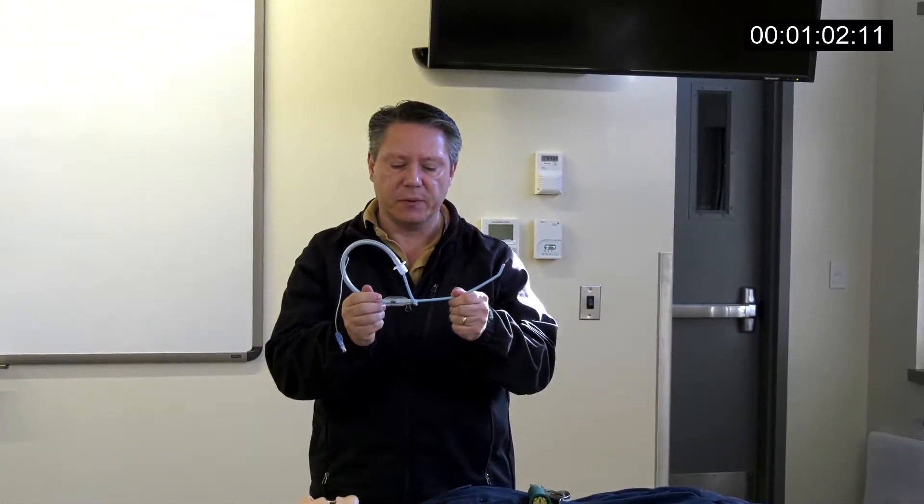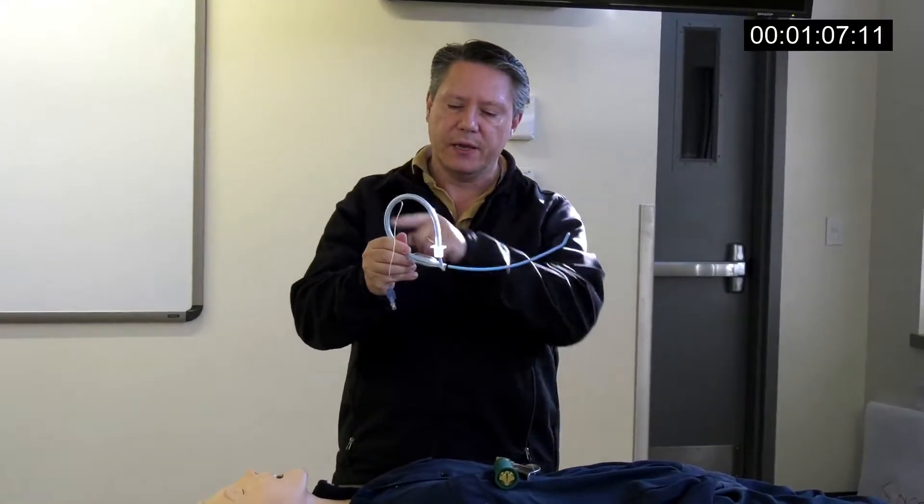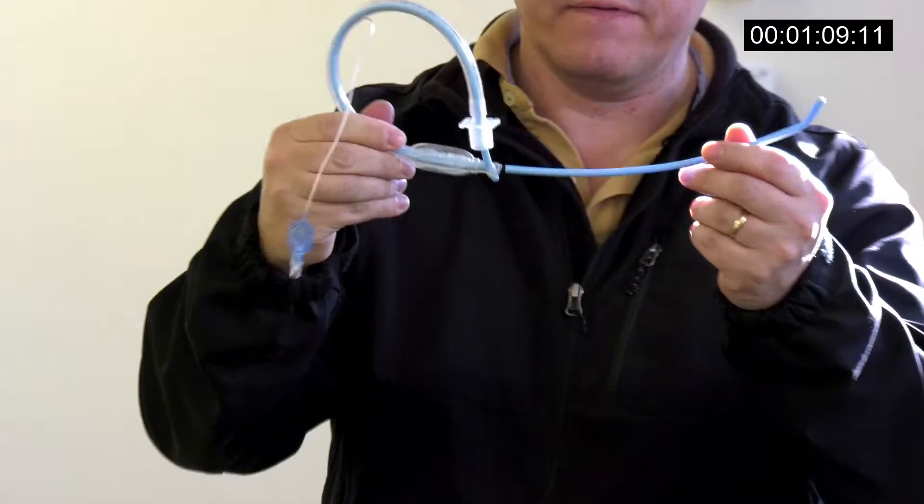The last thing you do is pull this until you get your little black line on the Eshmann, which is where your mouth is, and you get this nice little loop that makes this very, very stable.